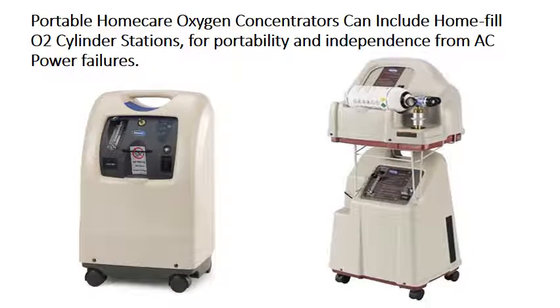One of the big advantages of portable oxygen concentrators is that they can provide a nearly unlimited supply of oxygen as long as they have reliable power, even at home. In the event the power is not reliable, it is possible to have a portable O2 cylinder station which will fill a portable cylinder as a backup.